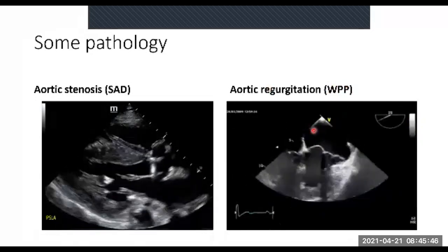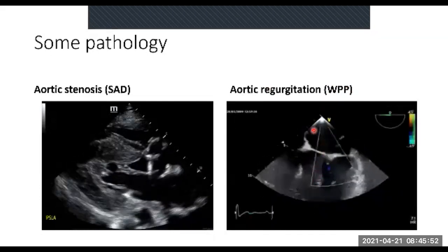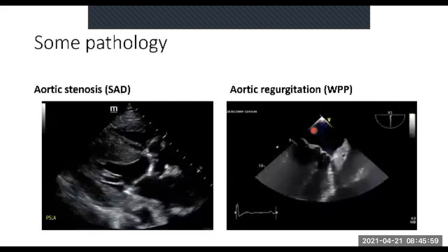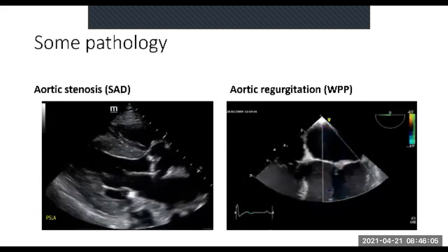It means you have a massive systolic and a very low diastolic, all right? Because in order to overcome the regurg, your ventricle has to push extremely hard. So all the blood goes into a tube, and then from that tube, everything falls back inside. So your blood pulse pressure is extremely wide. Okay. So these are all interesting things, and hopefully when we do valvular diseases later on, we'll discuss it in more detail.